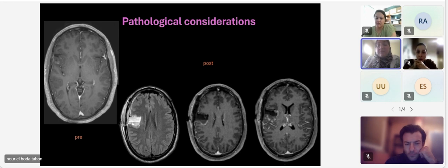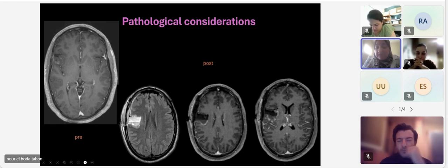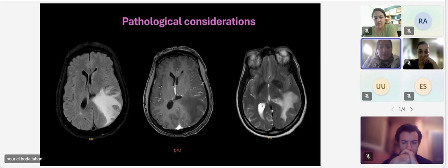If you see enhancement, maybe leptomeningeal metastasis. And even here, this enhancement around the surgical cavity, you don't know, maybe it starts to have recurrence, or maybe this is residual, they didn't take it out. Again, you can see some subgaleal hematoma and scalp hematoma, and this is expected as post-surgical changes as well.